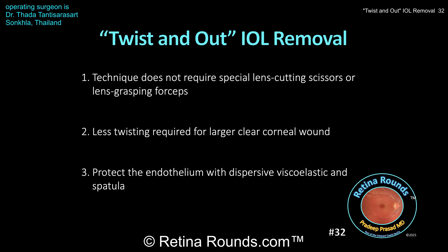A couple of important points regarding this technique: you'll notice that the lens is being held at the edge closer to where the externalized haptic is. You don't want to hold the lens in the middle so that you have plenty of room to twist that lens into a smaller dimension. You also want to start your hand position in the supinated position — palm up towards the ceiling — and then as you're twisting, you're going to pronate, turning that palm down towards the floor. That'll fold that lens up to a sufficiently small size to externalize through the clear corneal wound.